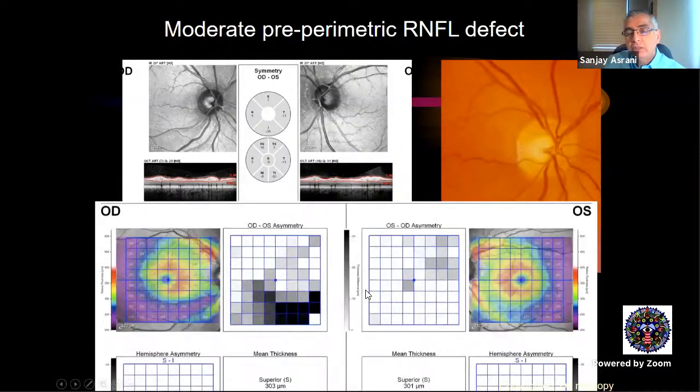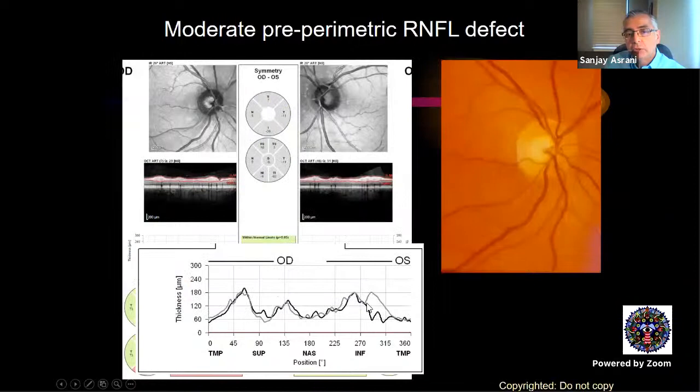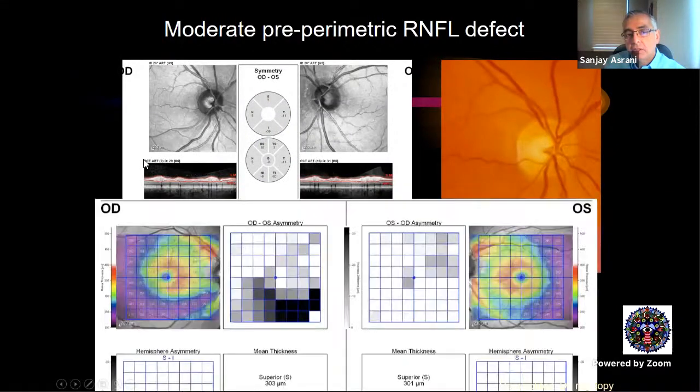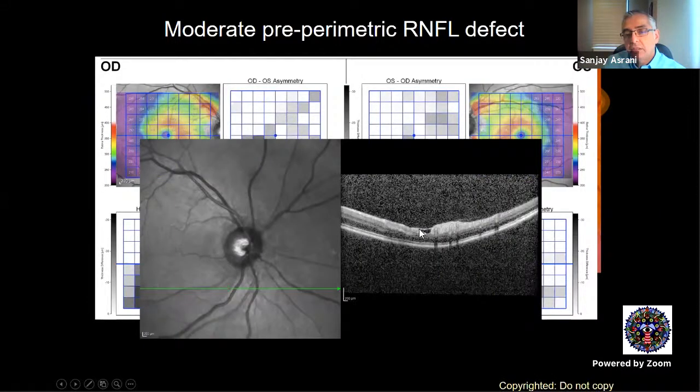And if you look at the macular thickness of this patient, you can see this loss right here, corresponding to this focal loss down here. You can see that loss. And you can see that the internal limiting membrane has not yet collapsed.